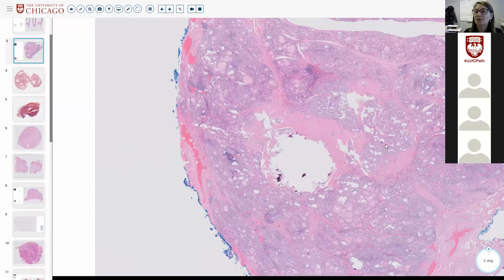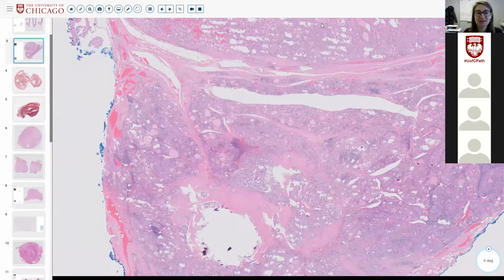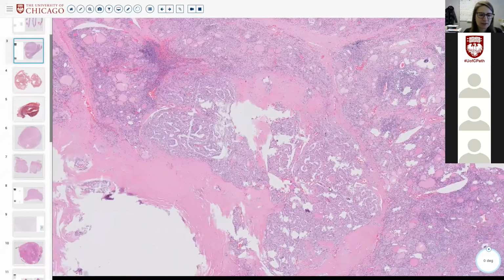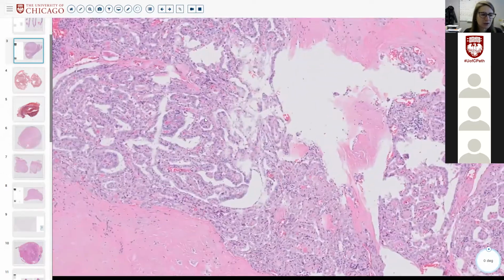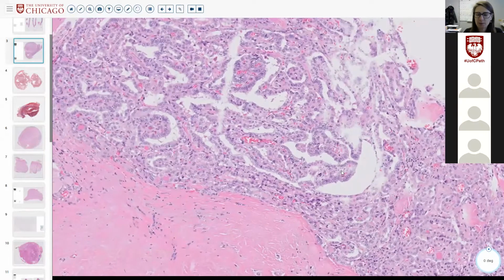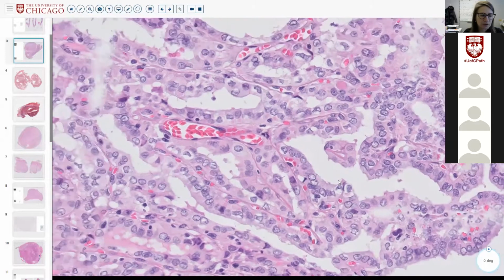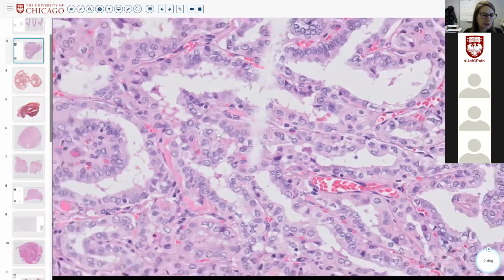Okay, sorry, I misunderstood. I thought it was invading a different structure and I was puzzled. Ah, got it. So is it the same as this? No, it's different. It has stromal fibrosis. It has architectural papillae, some nice papillae cut in cross section. And it has very wrinkled, grooved, folded, overlapped, cleared nuclei.